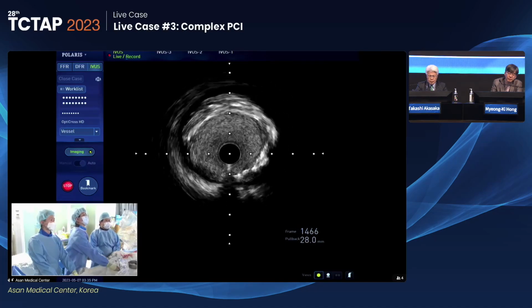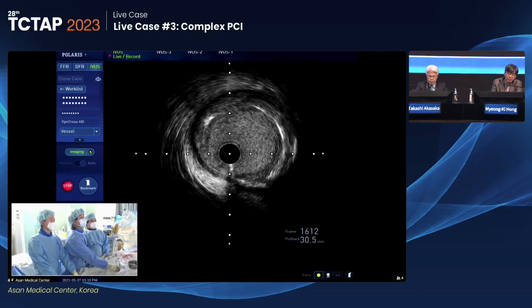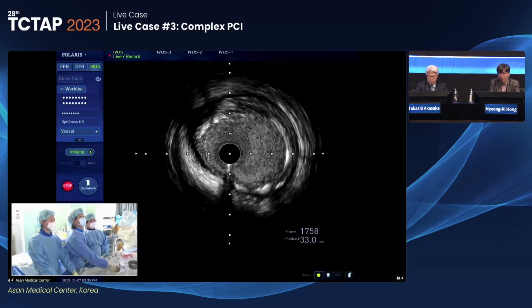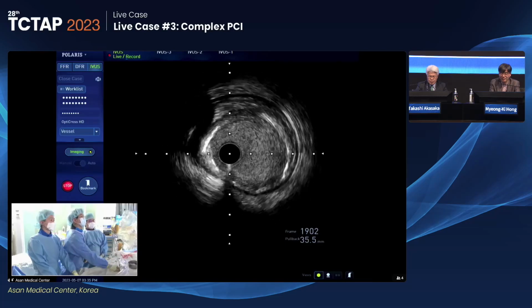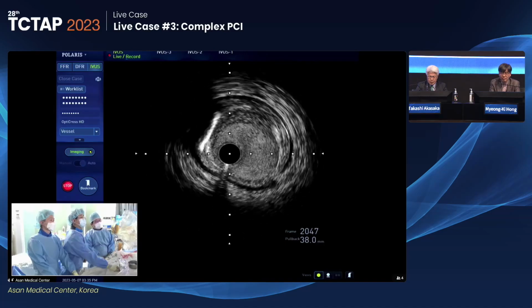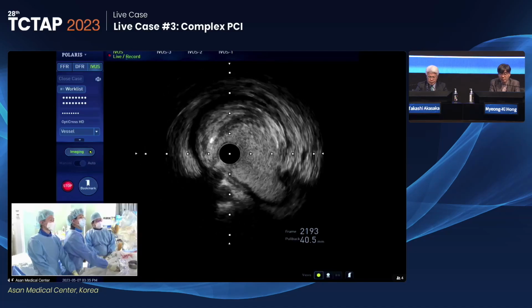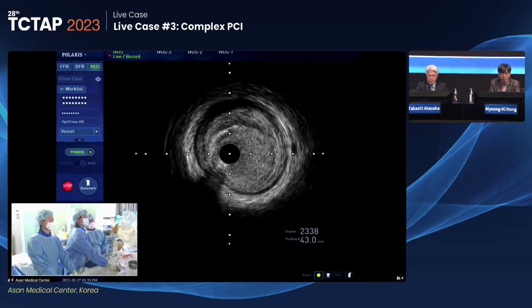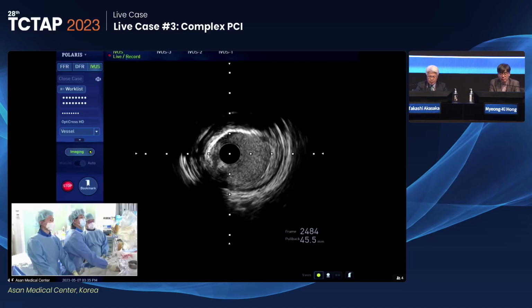So here comes the tightest portion. Balloon angioplasty works very well so far. Would anyone consider a drug-coated balloon for this segment, or just a fresh stent? Yes, if the stenosis is located only in the in-stent segment, then I prefer drug-coated balloon only treatment. But let's see how the LAD ostium and distal left main bifurcation look, with calcified LAD ostial stenosis. Agree.